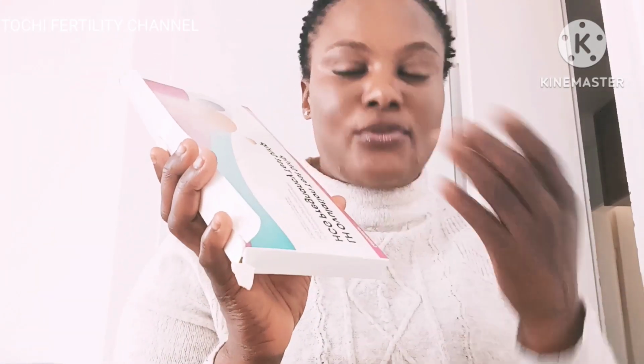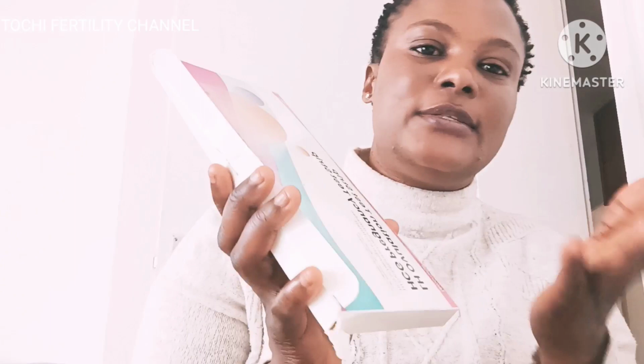This is very, very important for every woman that is trying to conceive. Make sure you have this. Some people will ask me, where can I buy it? If you go to any pharmacist, if you go to any stores, for those abroad in America, they sell it in stores. You can buy it online. It mustn't be this one, because people will come and be asking me, what is the name? I am interested. How can I buy it? Anything I'm displaying here, I am not selling. I am using it to teach, please. And I am not advertising for any company. So this is the one I used before I became pregnant. This thing can help you to detect the real day that your ovaries are ready to release an egg.